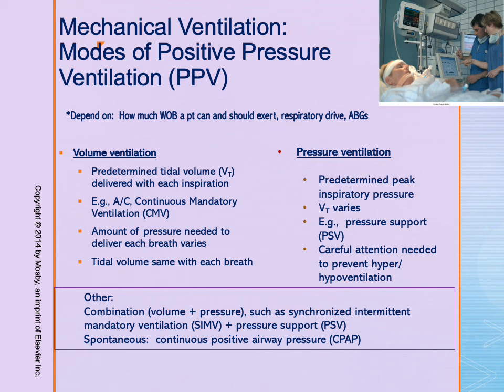On the bottom of this slide, you will see other types of mechanical ventilation. There are some combinations that are used. You don't have to be familiar with those, but just some examples of different modes that you will see.